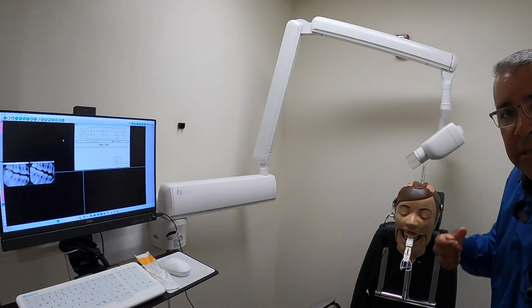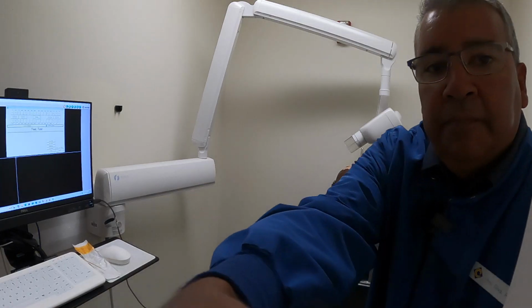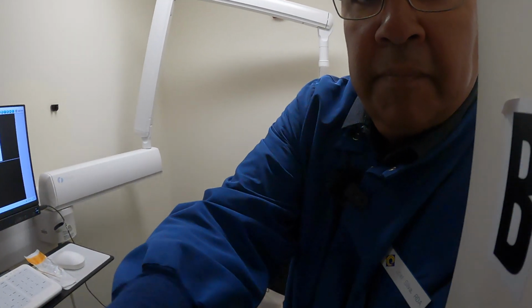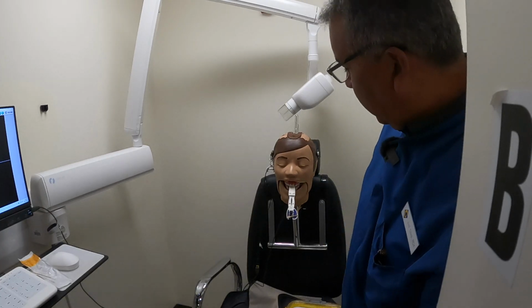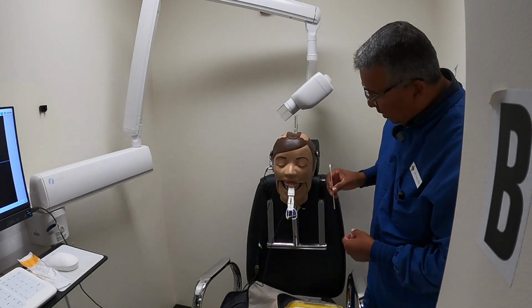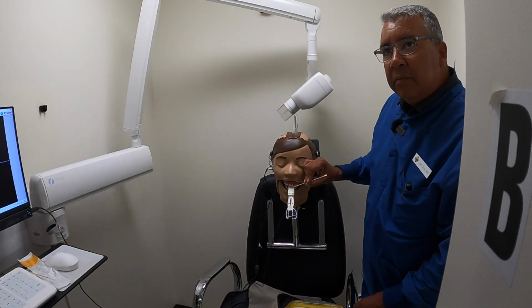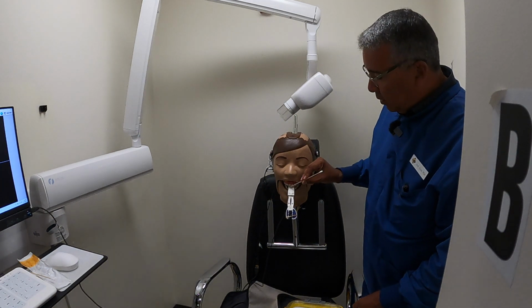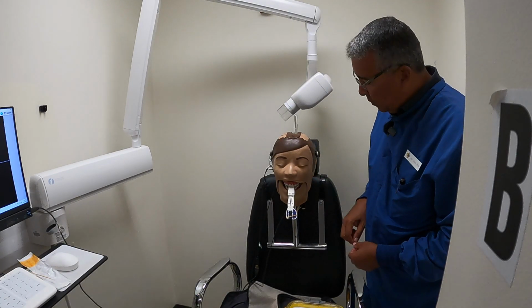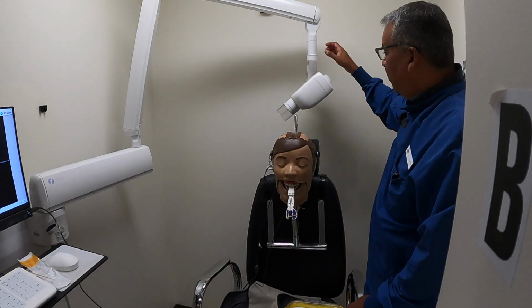Hopefully the camera will pick up on it. The incisal edges are a little bit away from that little half moon looking thing. We okay? Okay. So I put it at the same angle.